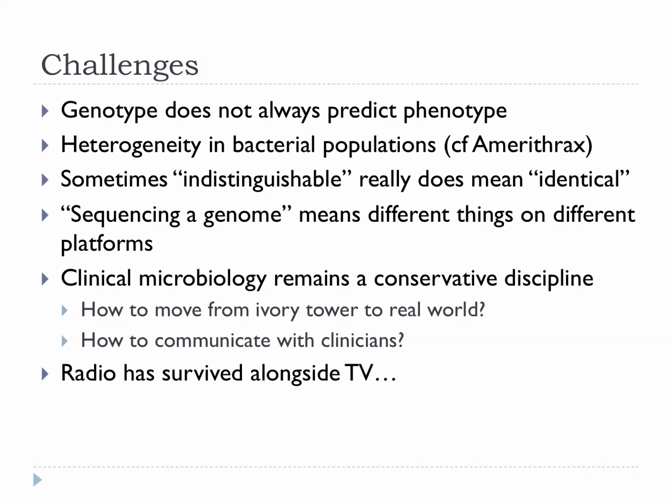That's at one extreme. The other problem is that clinical microbiology is a very conservative discipline, and I live in an ivory tower, you might argue. I mean, luckily my ivory tower is on the same campus as a real hospital, and we do talk to the people in the real hospital, but there is an issue about how we actually move this into a hospital environment. How do we communicate with clinicians? They stumble over long names like Stenotrophomonas. That kind of freaks them out when you use a bit of Latin and Greek on them. If you started giving them a long multi-page report telling them all about the SNP types and the virulence factors and the resistance genes, how's it going to work out?